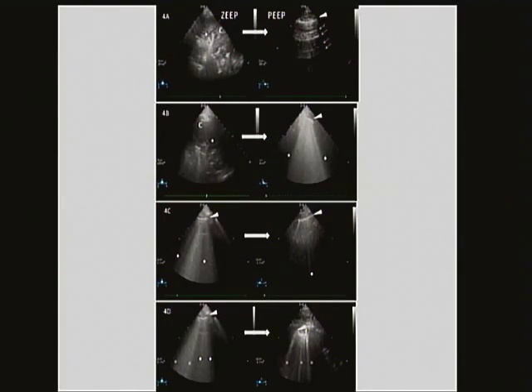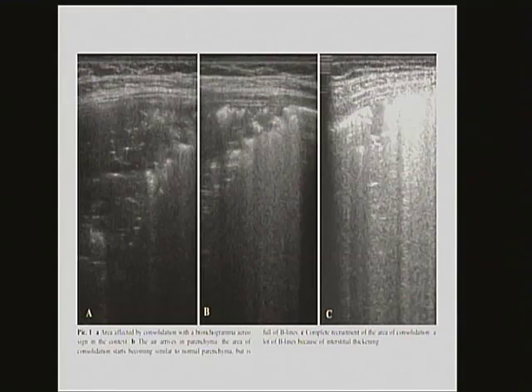But this was the first paper that showed that within minutes of changing the PEEP on your ventilator, you can actually demonstrate improved aeration in the lung tissue using ultrasound. And so to me, again, it's not necessarily the biggest impact on an emergency department patient, but think about all the ICU patients who are getting serial chest x-rays or even serial CT scans, going down for ARDS and traveling with your ventilator. It's very, very time consuming and cumbersome. So I think this has a lot of potential in those patients.